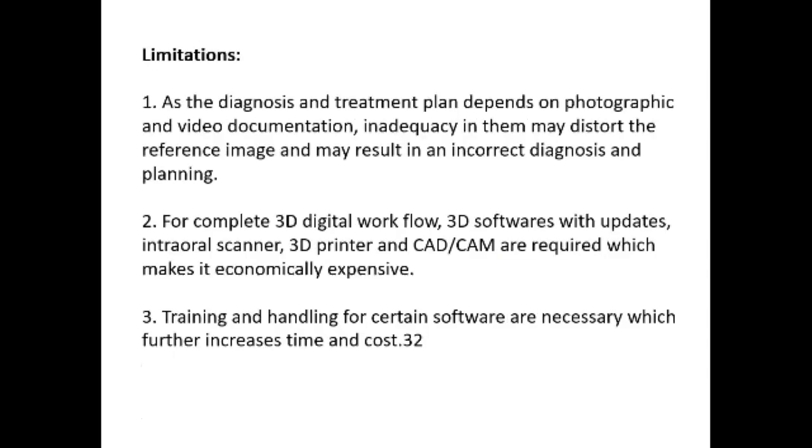And coming to the limitations, the diagnosis and the treatment plan depend on photographic and video documentation. Inadequacy in them may distort the reference image and may result in incorrect diagnosis and planning. For a complete three-dimensional workflow, 3D softwares with updates, intraoral scanners, three-dimensional printers, and all the equipment are required. And sometimes it can be economically expensive.